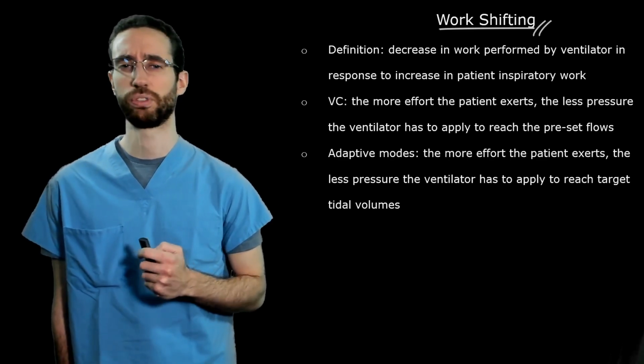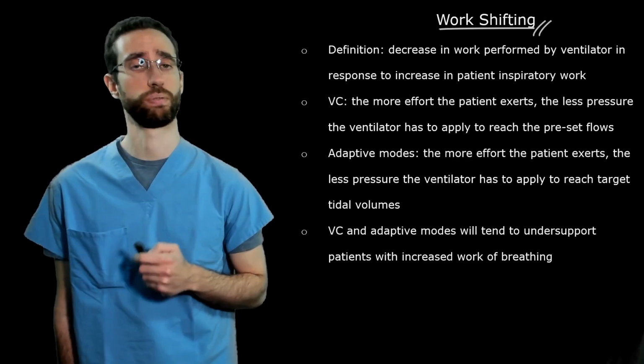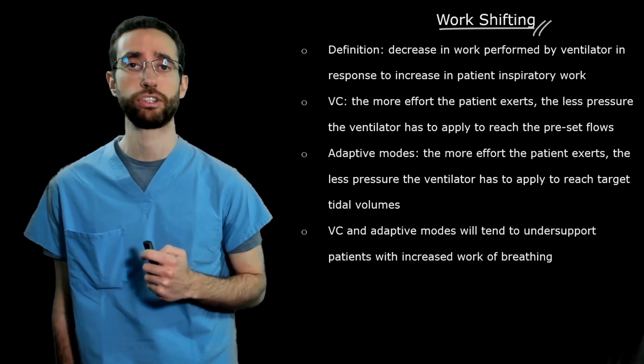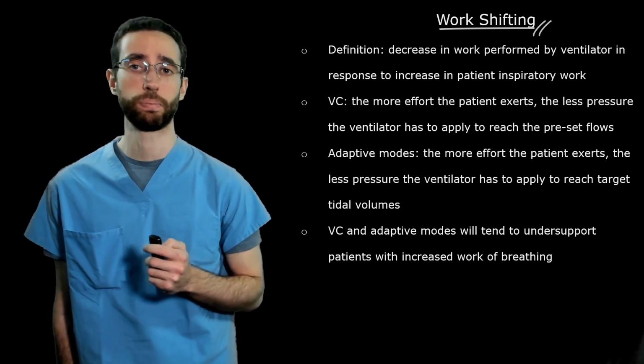Does that mean that these modes are inherently bad? Certainly not. It means that in the subset of patients with increased work of breathing, these modes may make it easier for a mismatch to occur between the amount of support we deliver and the amount of support that our patients demand.